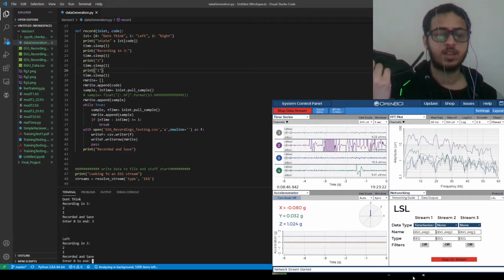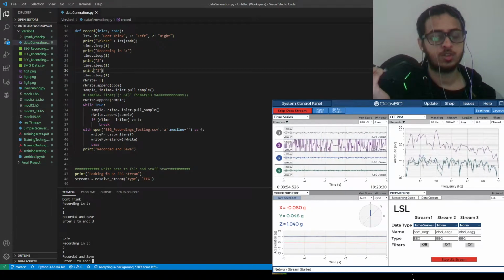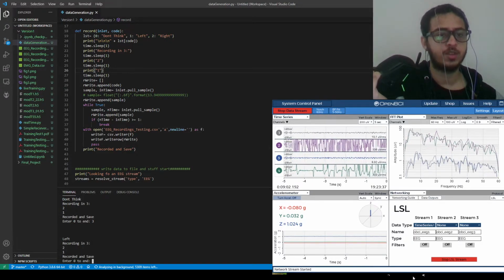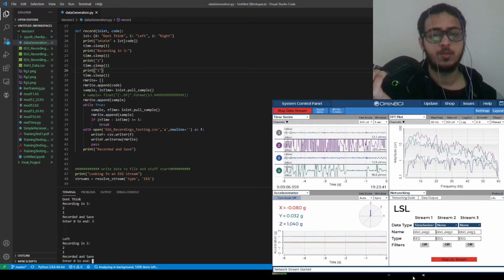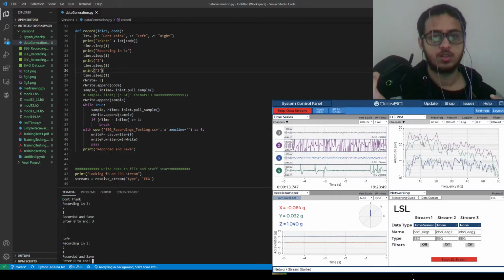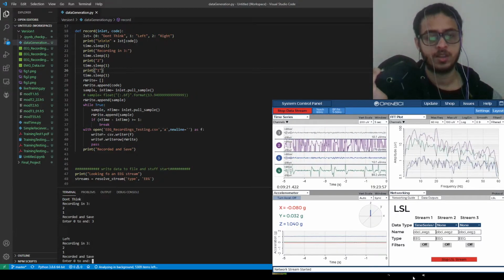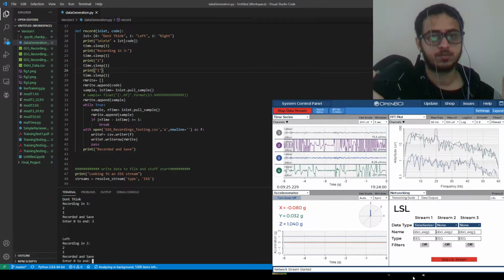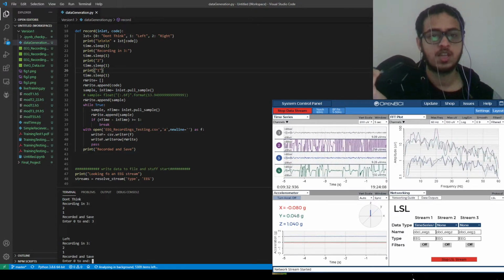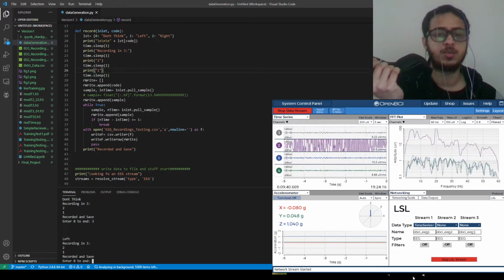Another thing about how I'm thinking: usually if I am thinking right, I try to concentrate, like clutch my right part of the brain. If you try to do that, you will get used to it later on. You won't be able to understand what I'm telling right away, but once you try to control those waves, you'll understand what I'm saying. When I think about that, I try to clench the right part of my brain, like how we clench our fist, to have some control over these waveforms shown in the video. Similarly for the left waves. So I'll pause the recording and record the rest, and show you the training and testing.